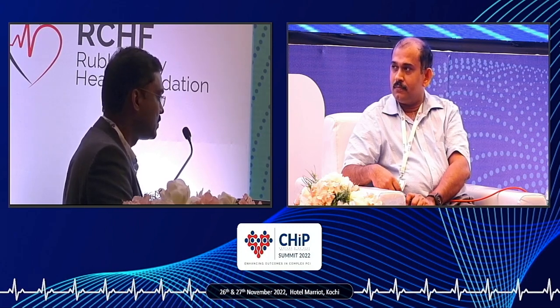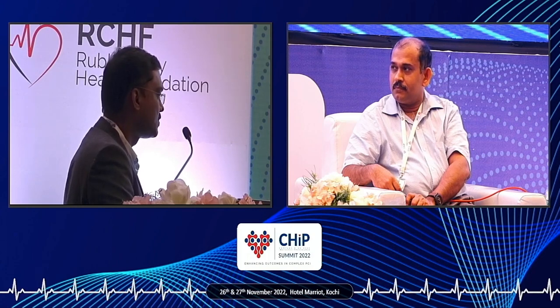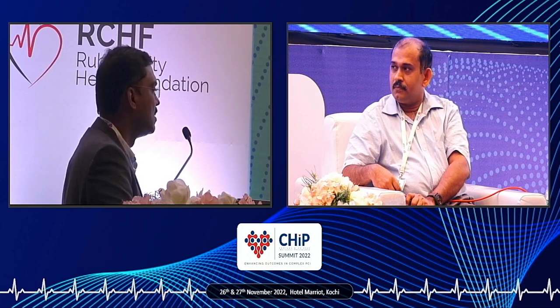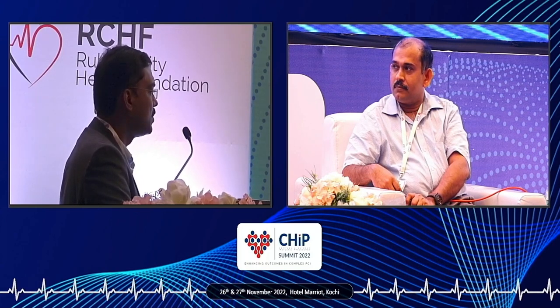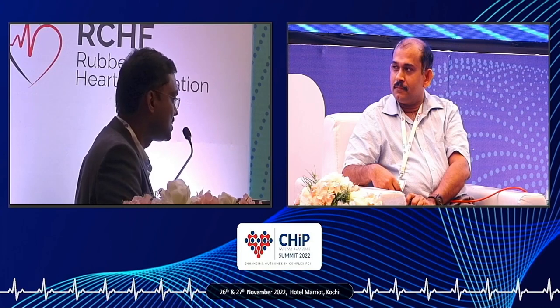If it is an under-expansion, you can just expand it with the help of a high-pressure balloon, or if there is persistent calcium, as the previous speaker told, you can do an IVL. Once you expand it, there are indications for DCB, there are indications for restenting. Only one trial is telling EES is better than DCB. Otherwise, of late, there are emerging uses of DCB. I am a favorite of DCB. I have got some follow-up also with DCB in in-stent restenosis.